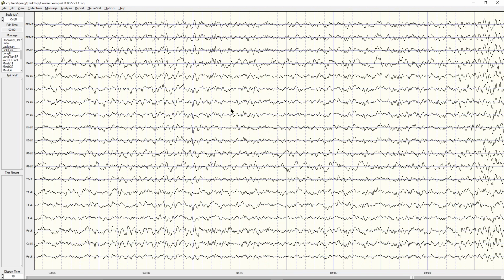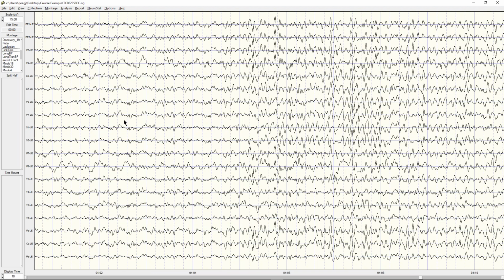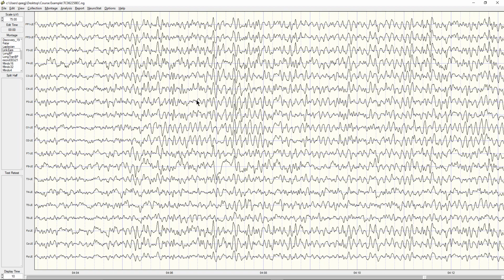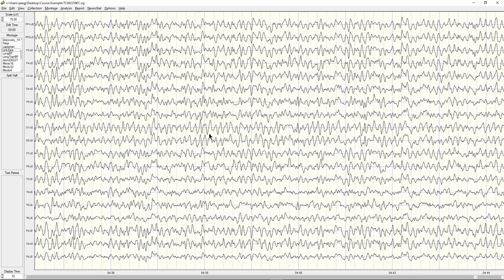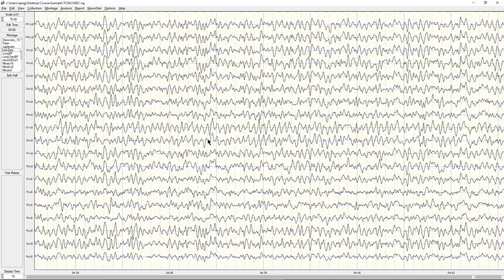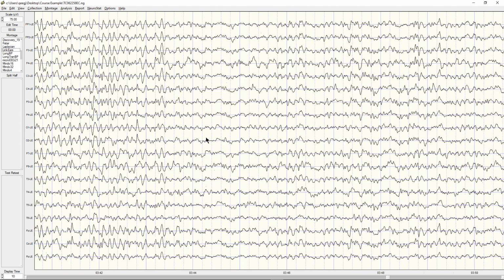She's getting a little sleepy here. The little alpha that she had is dropping out. She's dropping into sleep. It looks like just normal EEG, but it's not, because she's lost whatever alpha rhythm she had, and she's falling asleep. It's stage 1 sleep, and then she wakes up and her alpha rhythm comes back. I would want to not pick those sleepy segments for my data analysis. That's definitely a sleepy segment there.